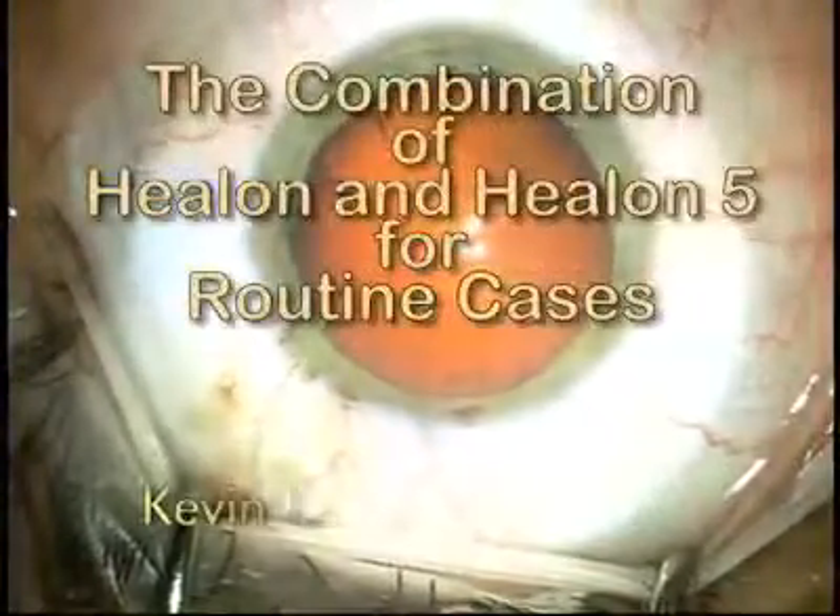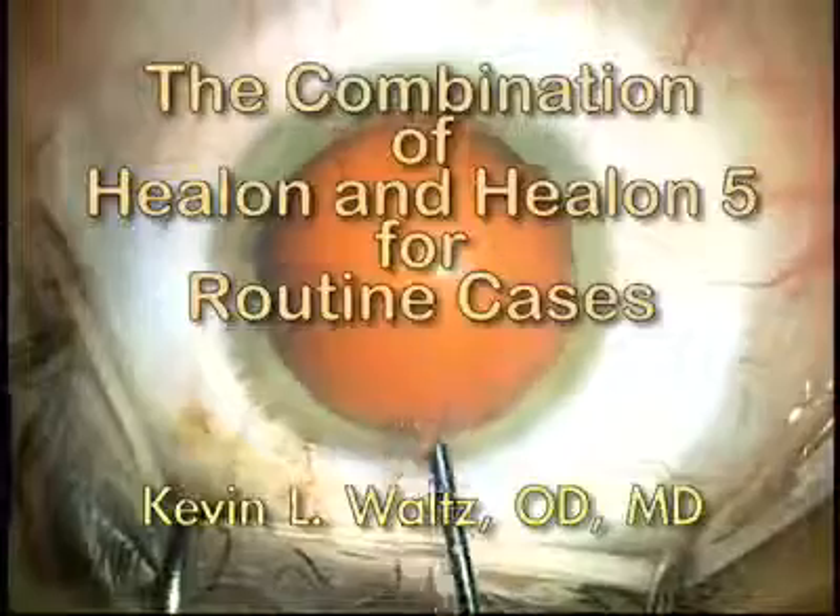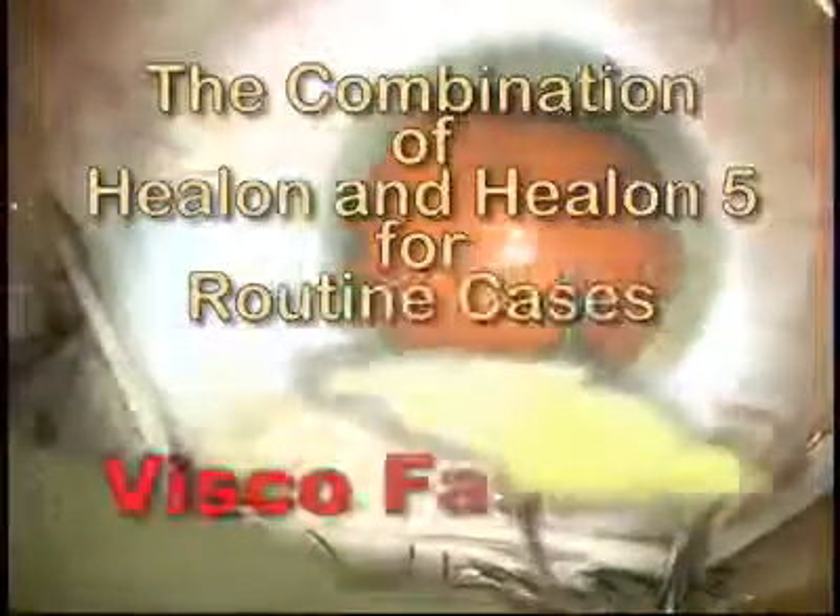This video shows the combination of Helon and Helon 5 for routine cases, or as I like to call it, the visco fastball.